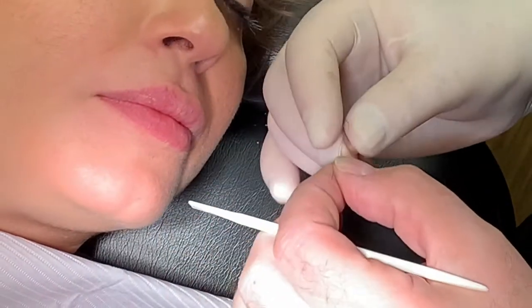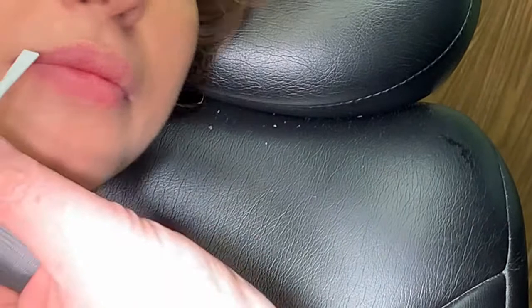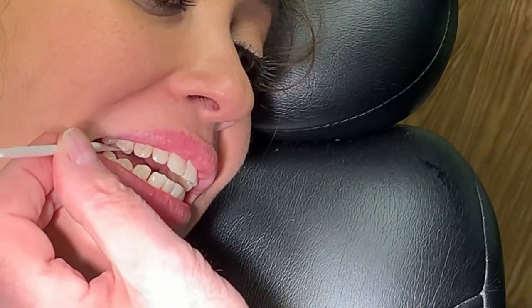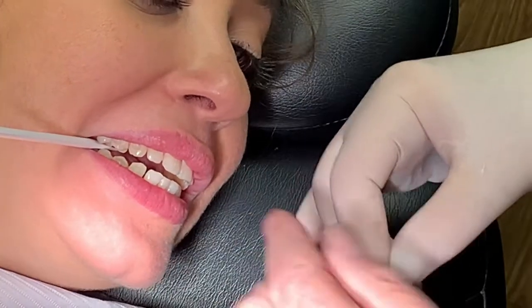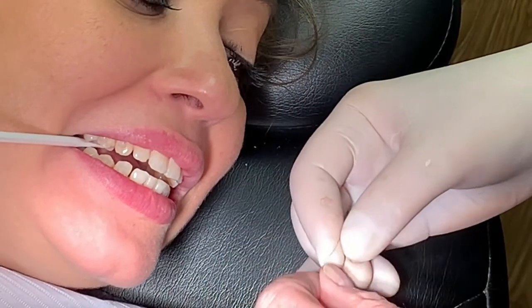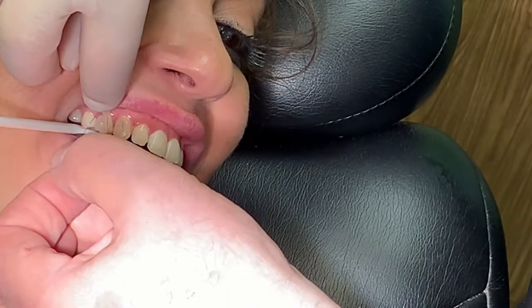So also in your kit is this white plastic straw. So you find the distance that makes you happy and comfortable, and you bite, and you hold that. Look at the distance now. You're learning the distance. That's where it's going to be approximately every time. Now, you put the wire, insert it into the slot.